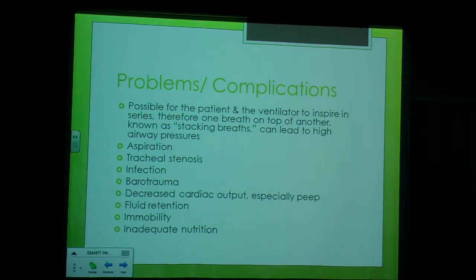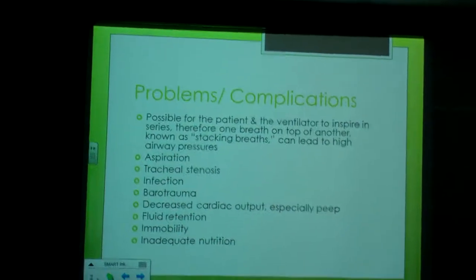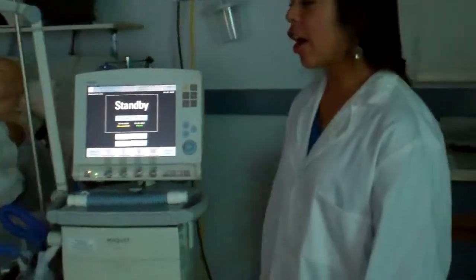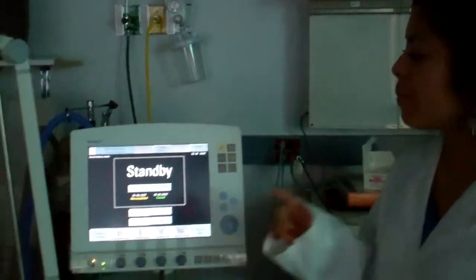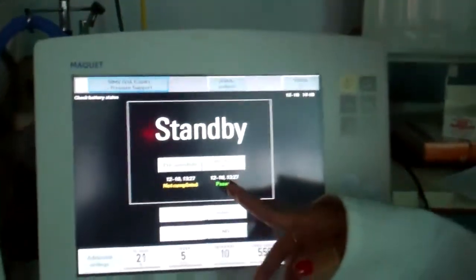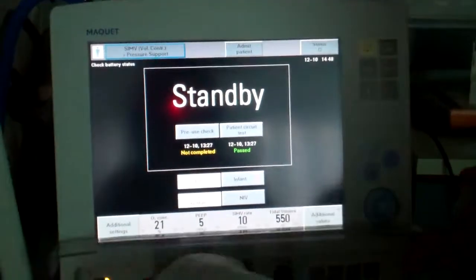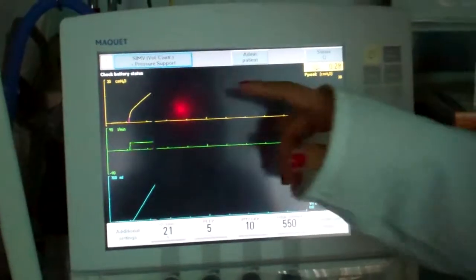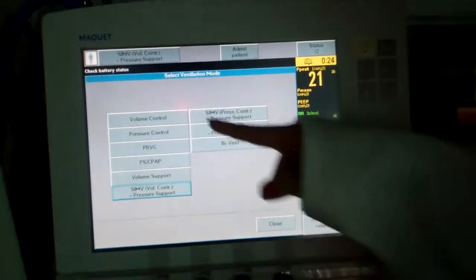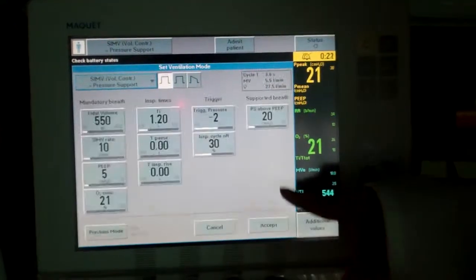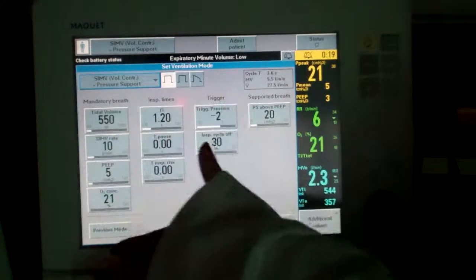Now we will demonstrate how to set up SIMV on the Servo-I. To start, you want to make sure you do your pre-use check and your patient circuit test. Once that is done, we are going to select a mode. Here are your list of modes, and we want SIMV. Now we are going to set up our parameters.